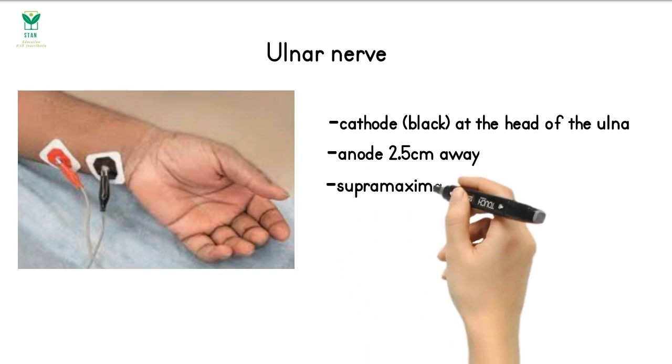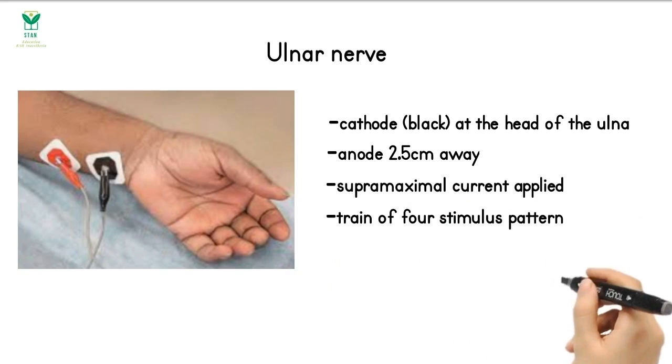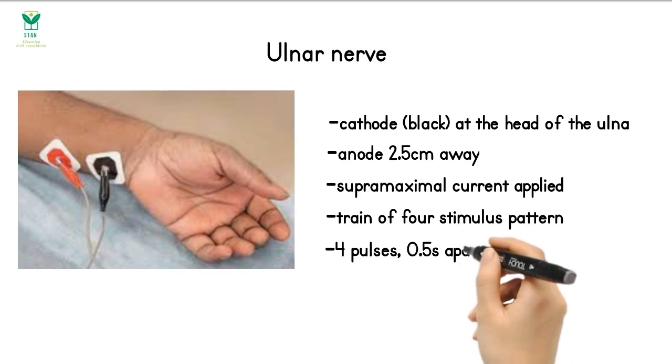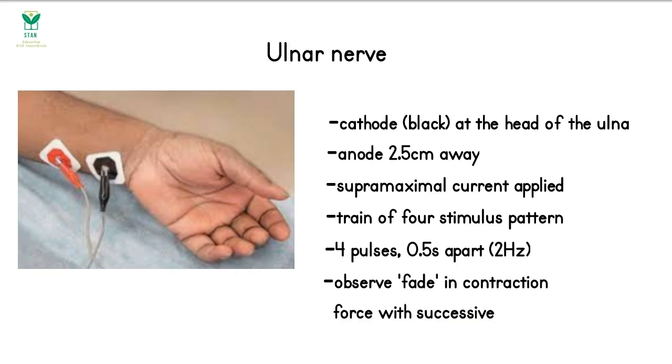Third, apply a supramaximal current, about 50 to 60 milliamps, in a train of 4 pattern. The train of 4 involves 4 pulses of current, each 0.5 seconds apart, that is a frequency of 2 Hz. As you're doing this, either observe or measure whether there's any decrease or fade in the force of contraction over the course of the 4 twitches.